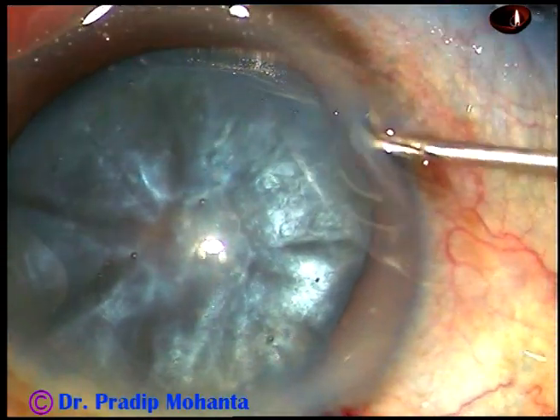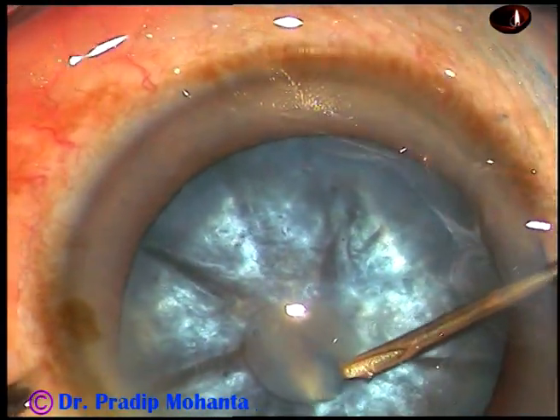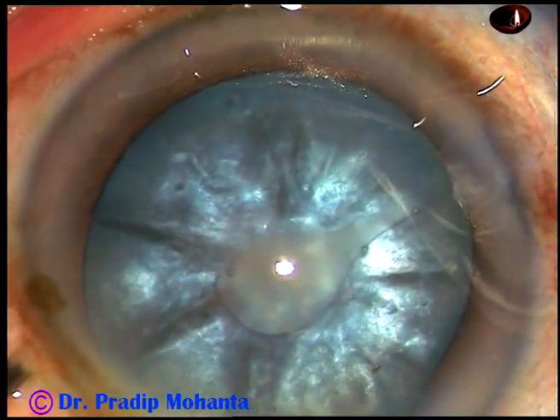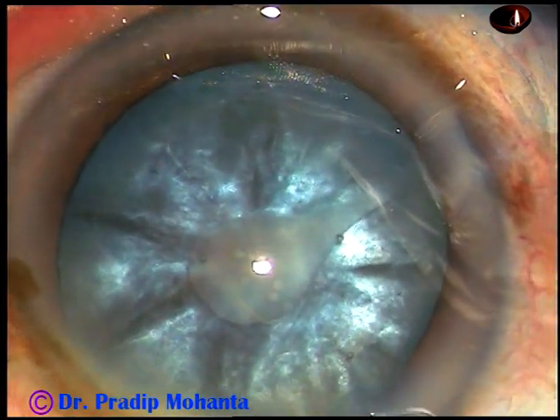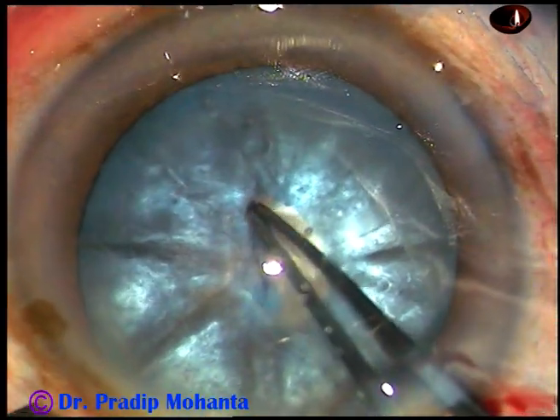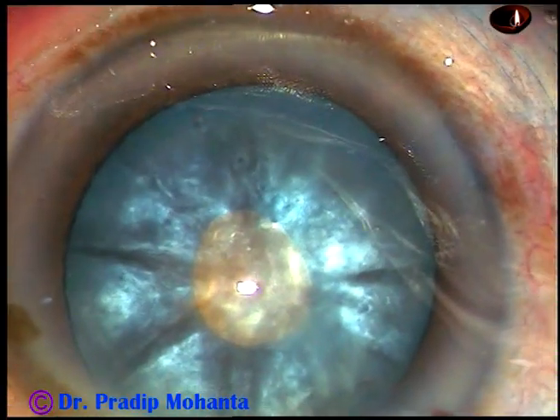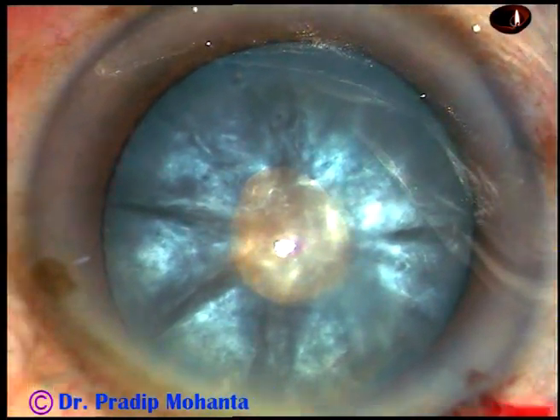And now see the rhexis. The anterior capsule is incised. I can see some oily fluid comes out. This incision should be like a C — a curved flap. And this capsular tag is converted into a small rhexis at this stage. We can call it a mini-rhexis.